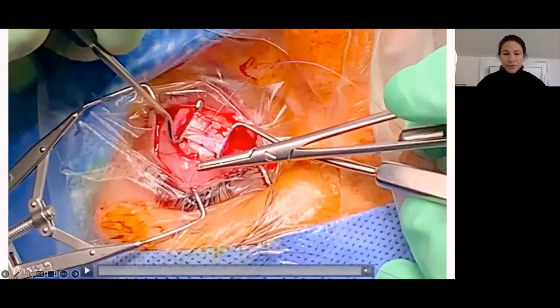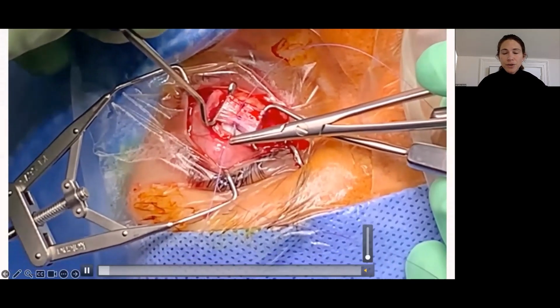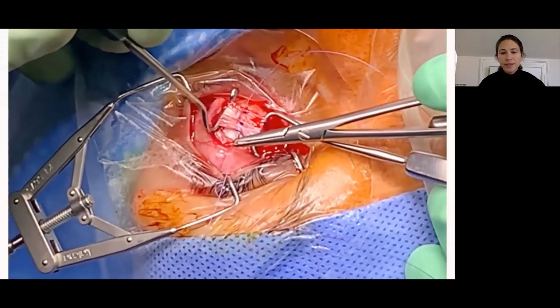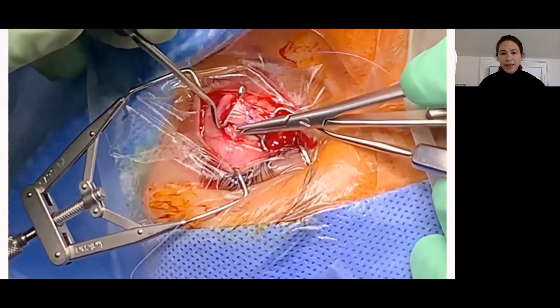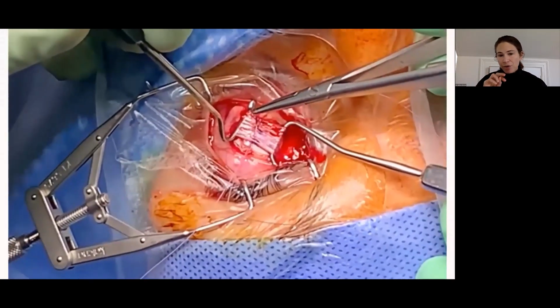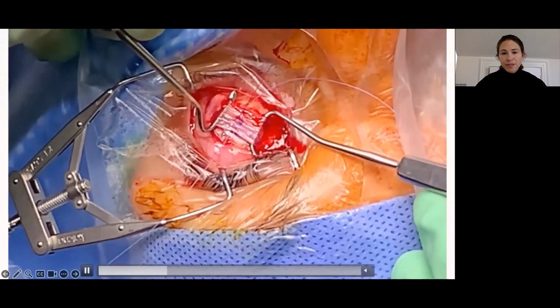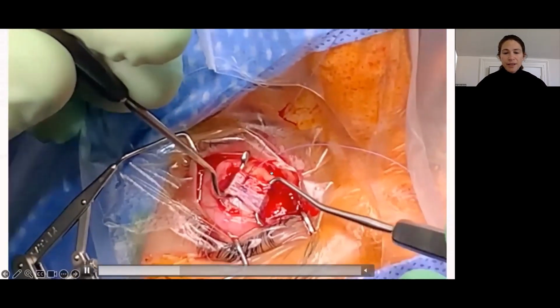So what we do in this technique, and this is me practicing his technique, or utilizing his techniques. So in this procedure, we set it up the same. I mark how much I'm plicating and I do my first partial thickness pass through the muscle, but then I actually go back through my original holes. So I go back through my hole that I exited the muscle here, and I exit the hole that I had entered the muscle in the center.